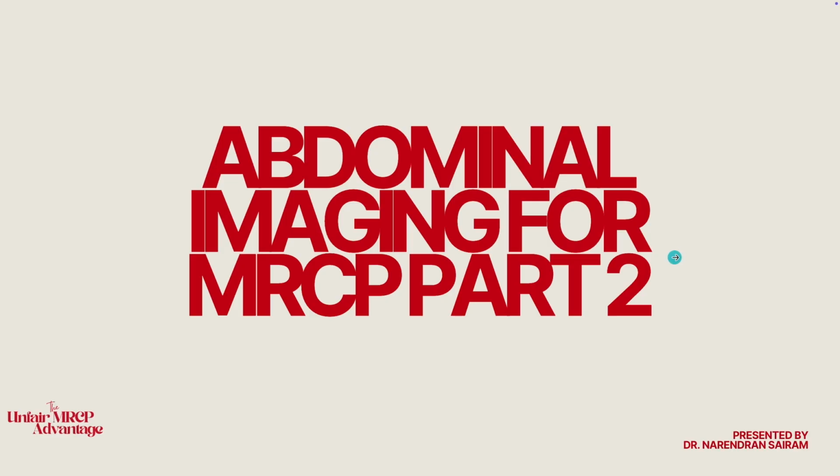Anything is definitely possible because there's no way to predict exactly what they will ask, but most of the time you will be able to figure out the diagnosis or the management from the clinical scenario itself, and the image will just be corroborative or supportive evidence for you. But these particular images, it's important that you identify, because you may not be able to make a diagnosis without being able to properly diagnose these images.